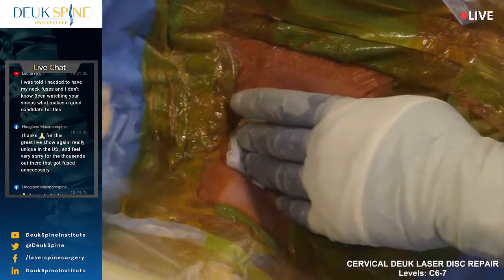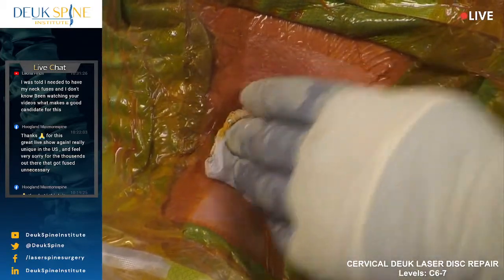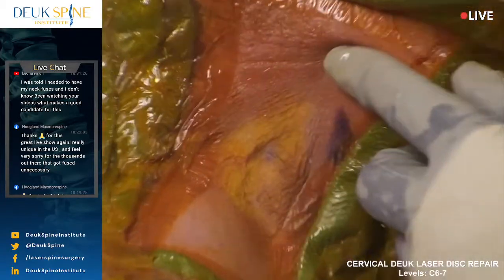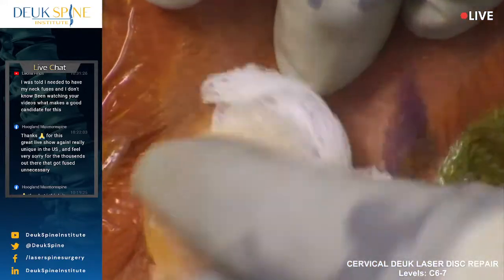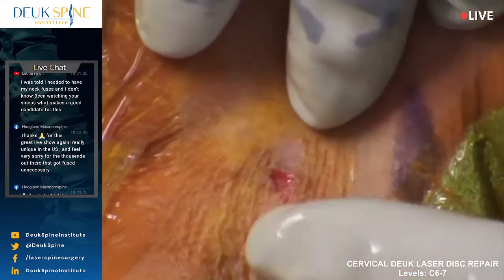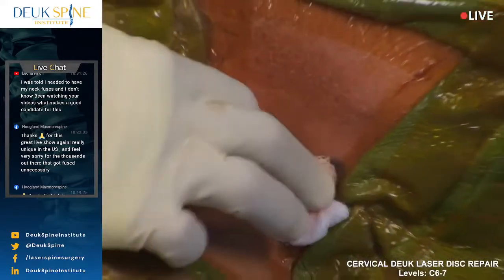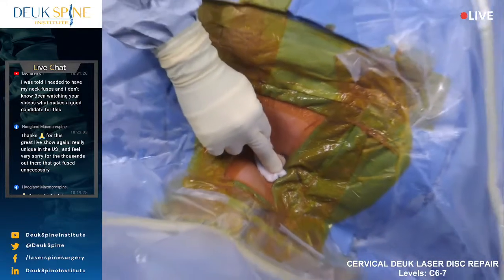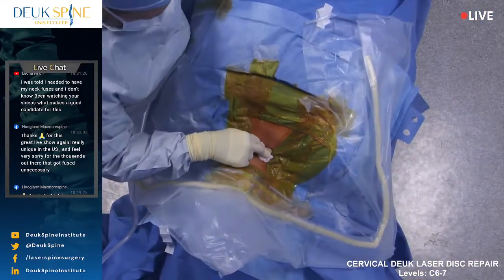All right, so Diego, you want to see this incision? Yep, we're zoomed up. You guys ready? Look at this thing. You can't even see it. It's like it closed itself. There it is. Basically 4 millimeters. 1 drop of blood we lost. There's 20 drops of blood per milliliter, so we lost 0.05 milliliters.